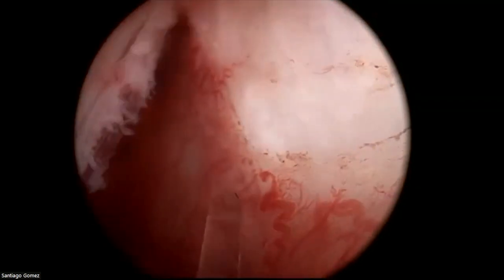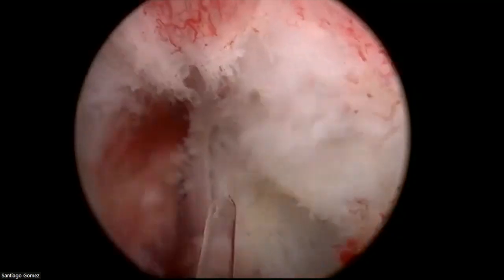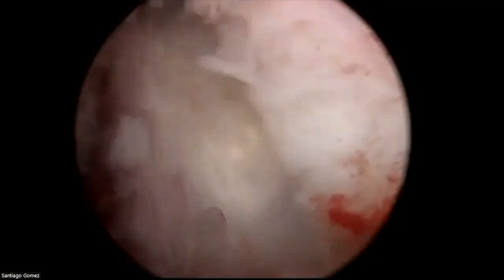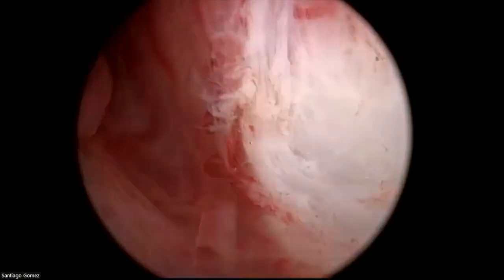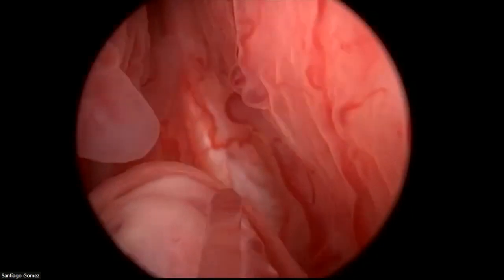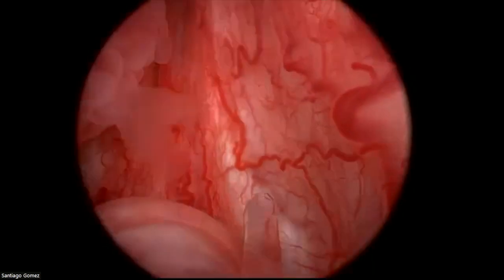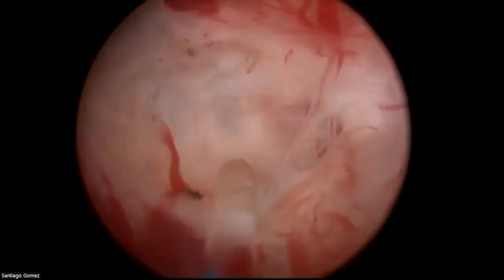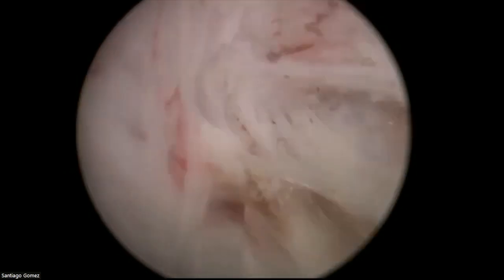Sometimes there will be a little bit of bleeding. You see that the mucosa is very well vascularized. But if you cannot see very well, my advice is to go in the plane very fast. So here you can see the floor of the verumontanum, you see. So here I'm going to come and try to enter the plane. Let's see.